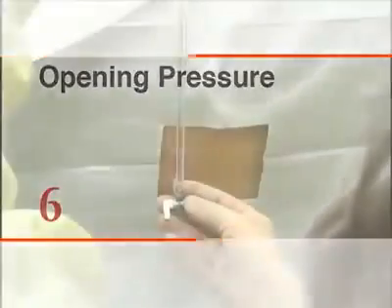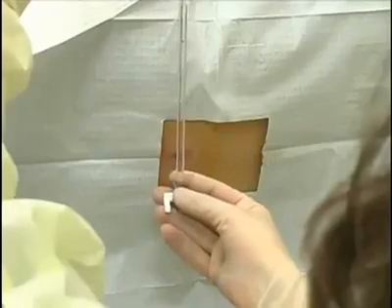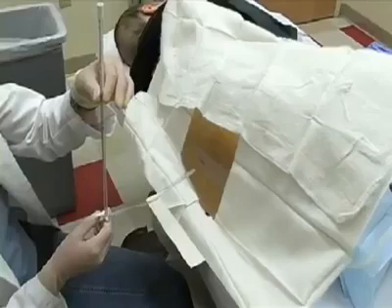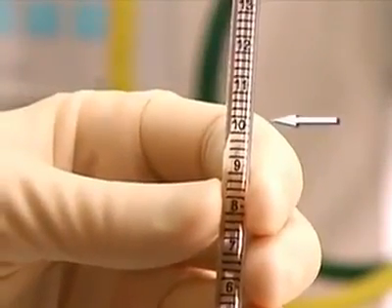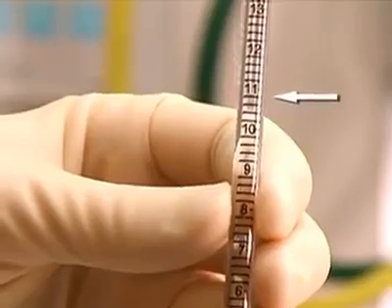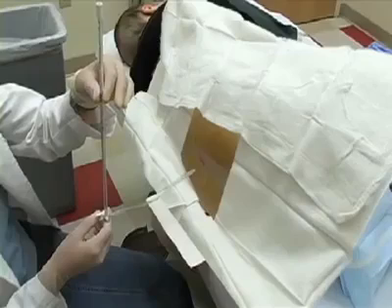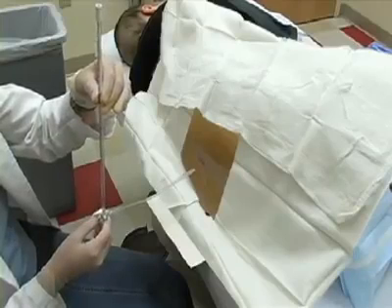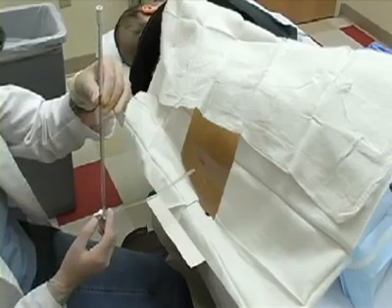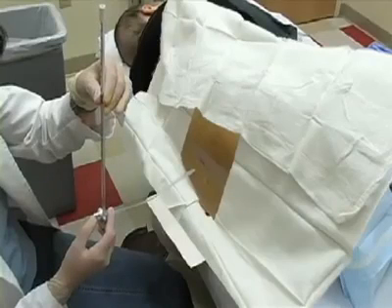To obtain an opening cerebrospinal pressure, the patient must be in the lateral recumbent position. Use a flexible connector and attach a manometer to the hub of the spinal needle. After waiting for the column of fluid to rise and possibly seeing pulsation from cardiac or respiratory motion, you may take a measurement. If the cerebrospinal fluid pressure exceeds 25 centimeters of water, you should closely monitor the patient for signs of herniation and determine the cause of the patient's elevated intracranial pressure.